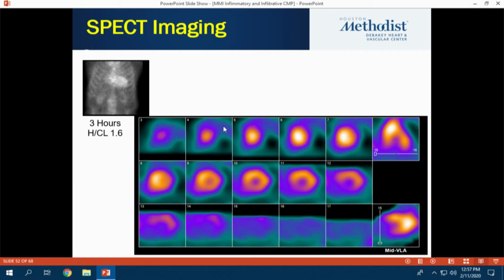Now, we went ahead and did an additional step where we actually did a SPECT. Now, think of SPECT as moving from a chest X-ray to a CT of the chest. Now, I see where the counts are coming from. This is easy if there is strong uptake because I can go and look for the heart. But if it is not that easy, if the uptake is a little bit faint... But this one looks like a regular nuclear scan where the PYP signal is coming specifically from the myocardium. So you're pretty sure that this patient has ATTR amyloid.